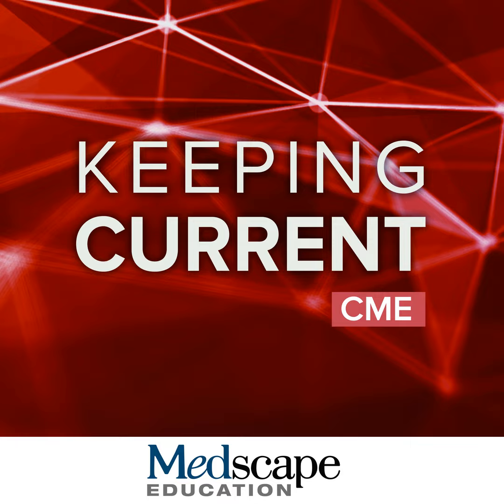And they all had the GRE T2 star. If they also have SWI, we add that on. That way we can assess the greatest risk up front and not be surprised by it. But it does mean that we'll probably miss some of the small findings during monitoring. And it's just one of those tough choices. We decided that this compromise worked for us because we wanted to be able to treat patients where they lived.